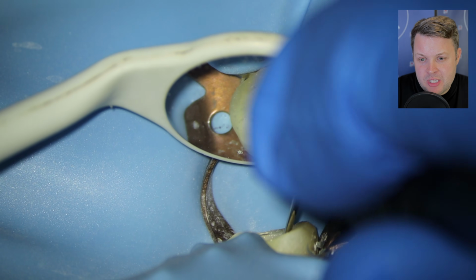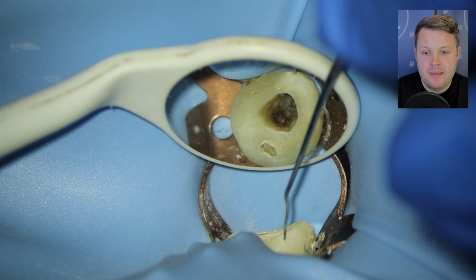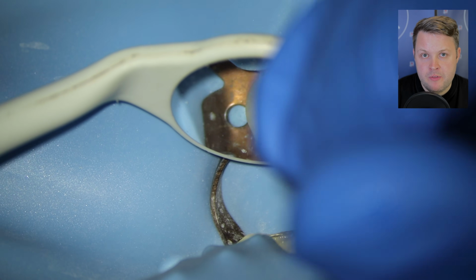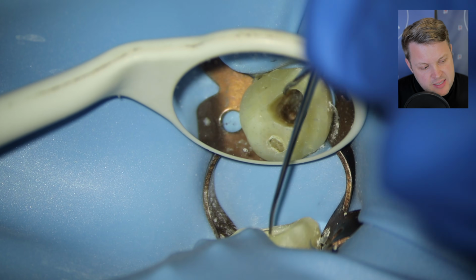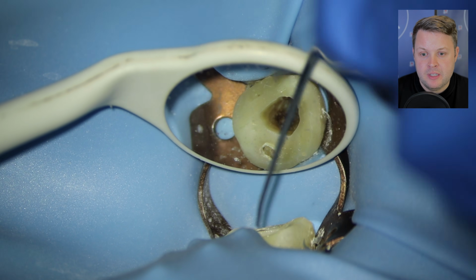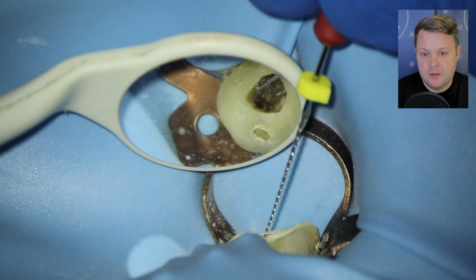easy. And I'm using this GP remover, which has quite a long end with a little hook at the end, and I'm just trying to remove some of this GP, because sometimes you'll notice that you can't get to length and you're getting this kind of hard stop, and then when you remove some of the apical GP, this is when you get to length quite nicely.